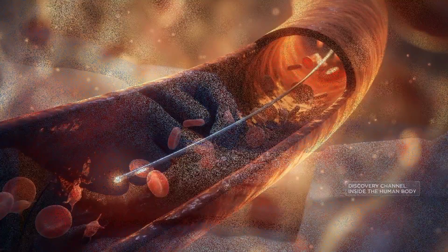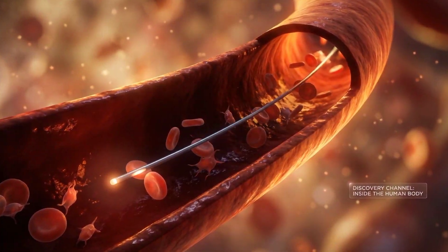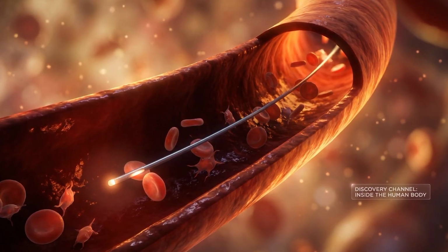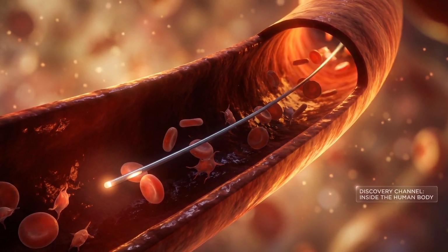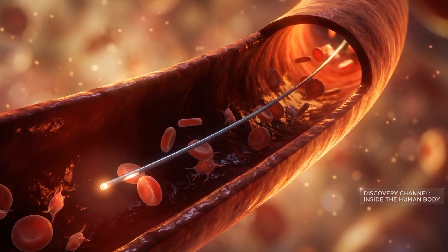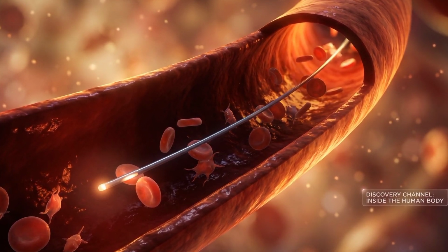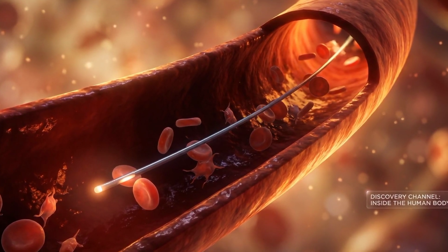So what will they do in angioplasty? See this image. Like this, they insert the catheter from the wrist and it goes into the blood vessels. A small balloon attached to a catheter is positioned at the blocked area.